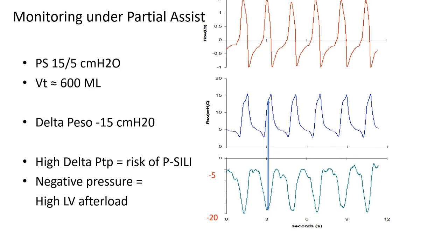He's distending the lung because his respiratory drive is stimulated by factors in the lung, not only the gas exchange, and this patient may be at risk of developing what we call self-inflicted lung injury. If you don't know that, you may simply switch the patient to pressure support and see the next day that the patient has worsened or has developed a pneumothorax, as described now in several case reports in the literature. So I think it's a very important information. You need a monitoring tool to see that. You need either a dedicated monitoring or a ventilator.